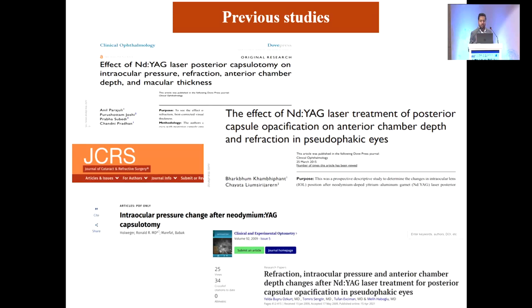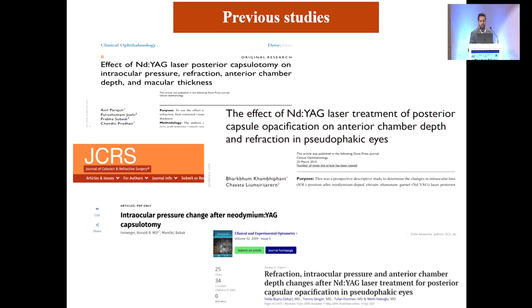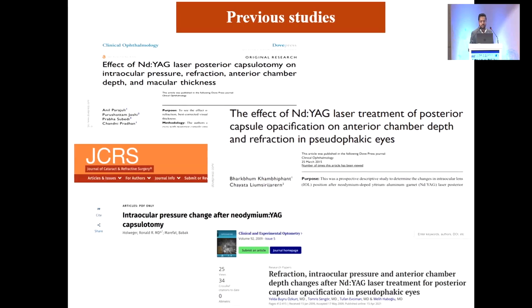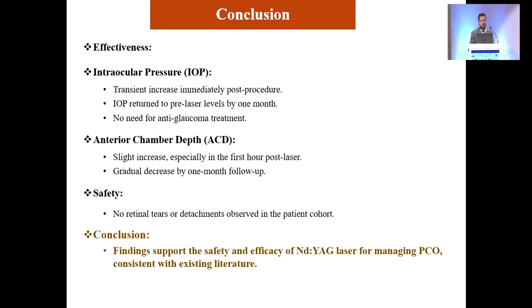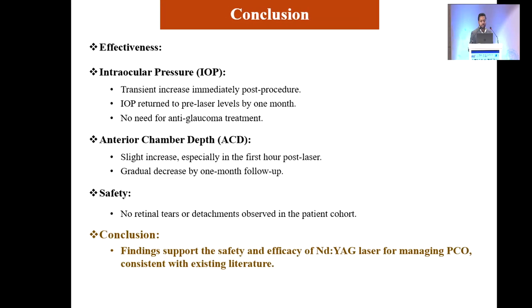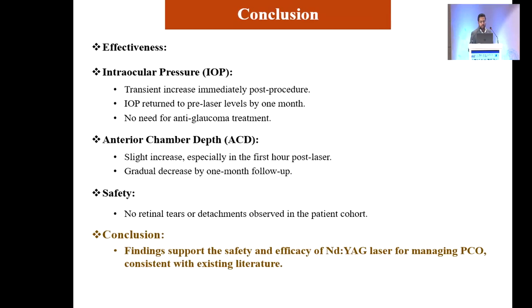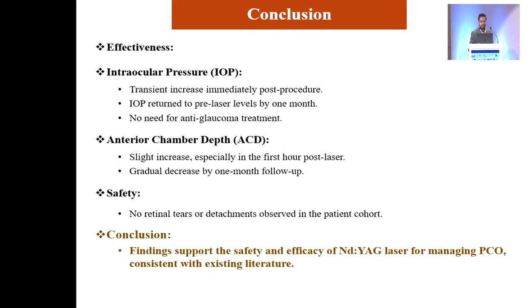The previous studies also include the changes in intraocular pressure and anterior chamber depth by Nd:YAG laser capsulotomy. They mentioned that there is an increase in intraocular pressure, but no change in anterior chamber depth. But in my study, I have noticed that there is a transient increase in intraocular pressure immediately post procedure, but IOP returned to pre-laser level by 1 month, and anterior chamber depth has a slight increase, especially in the first hours post laser, and it gradually decreases by 1 month follow-up. Findings support the safety and efficacy of Nd:YAG laser for managing PCO, consistent with the existing literature.